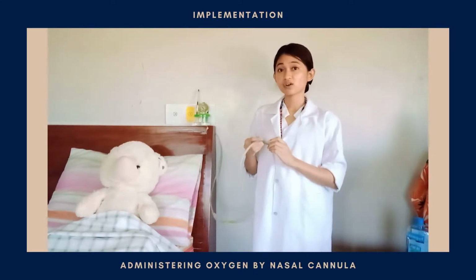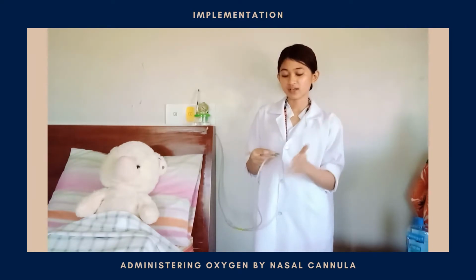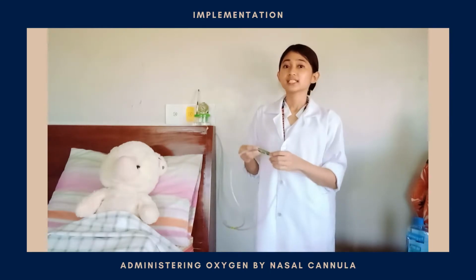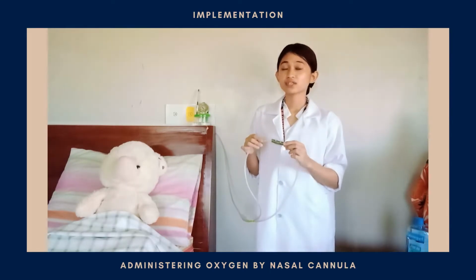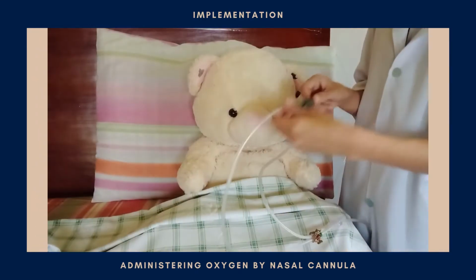Then, check that oxygen is flowing out of the prongs by simply placing our hands in front of it and feeling for air that is passing out. This is to check for the patency of the tubing and determine if there is an obstruction.